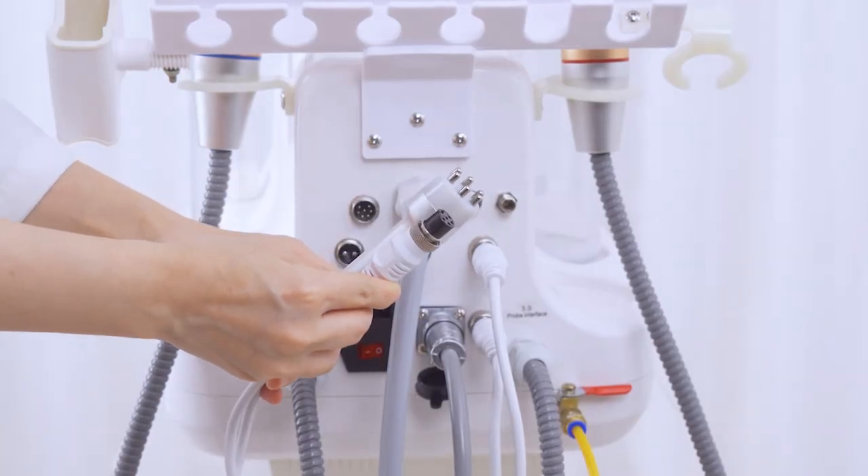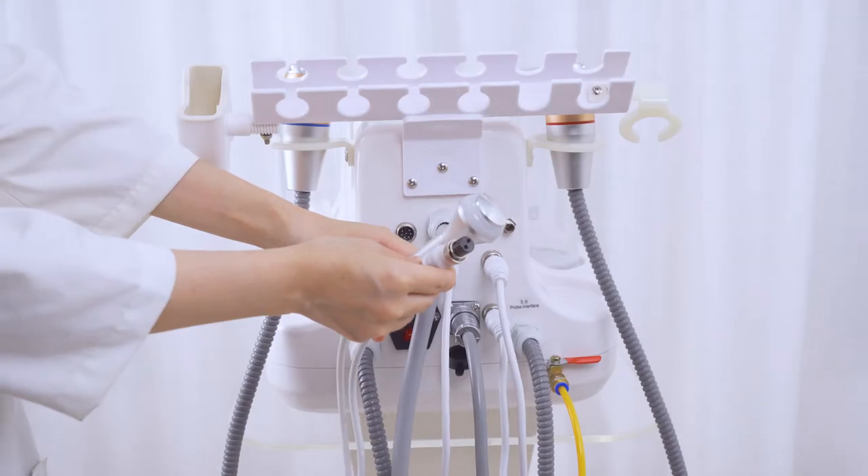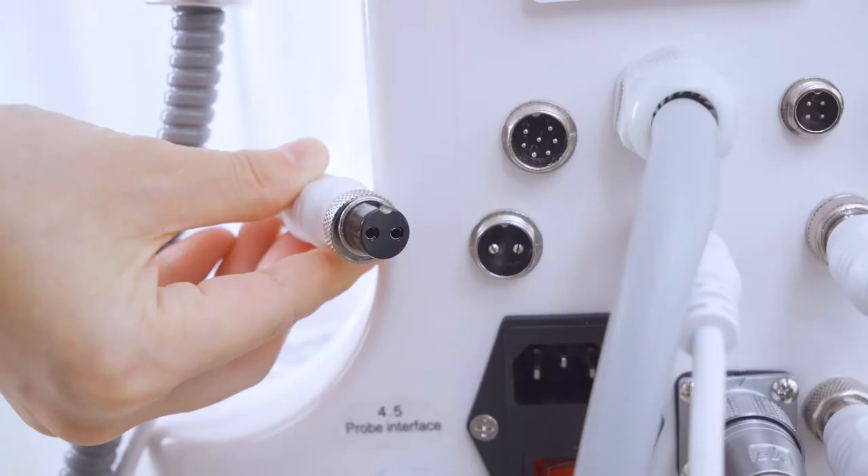Connect the RF radio frequency handle with the device and tighten the screw. Connect the ice repair handle with the device and tighten the screw.